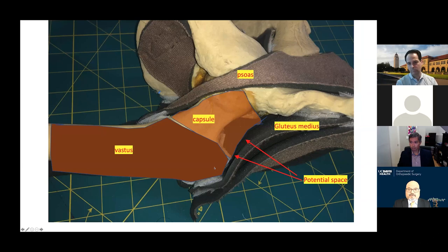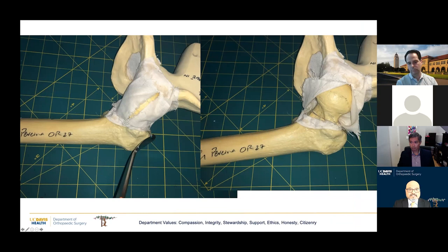Here's a trick I learned from a ViewMedi video. During the anterior approach, before I make my capsulotomy, I create a potential space between the gluteus medius tendon and the greater trochanter. I put a Hohmann in there and release the soft tissues — which are minimal — but this allows the superior capsule to be identified. When I finally do my capsulotomy, I make my release right there, which helps later while addressing the femur.